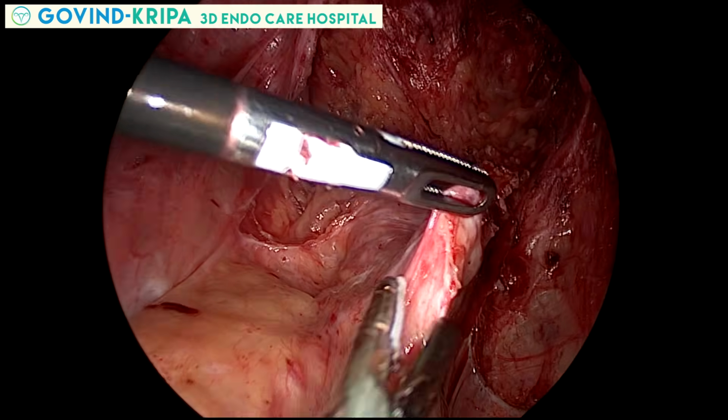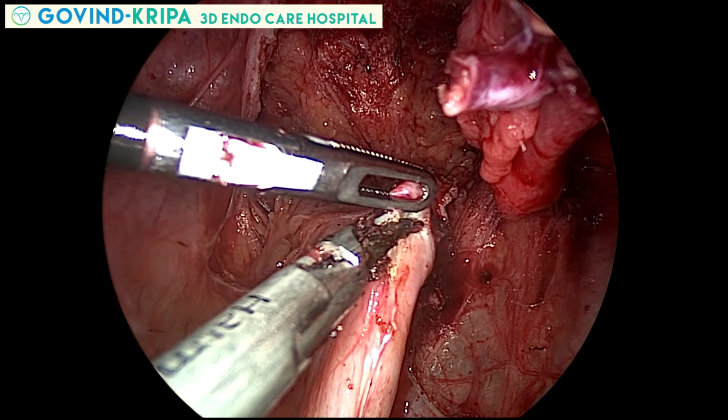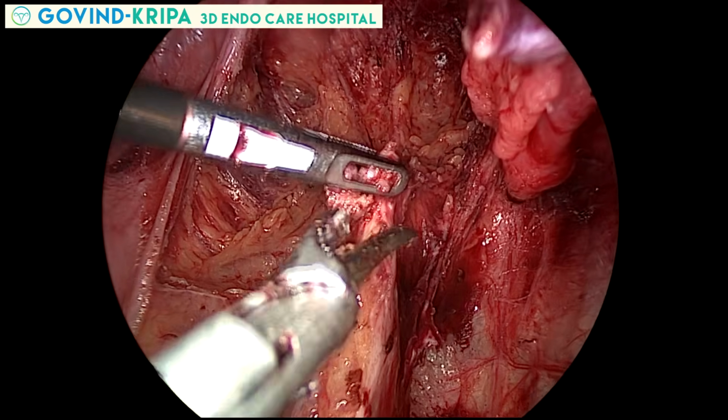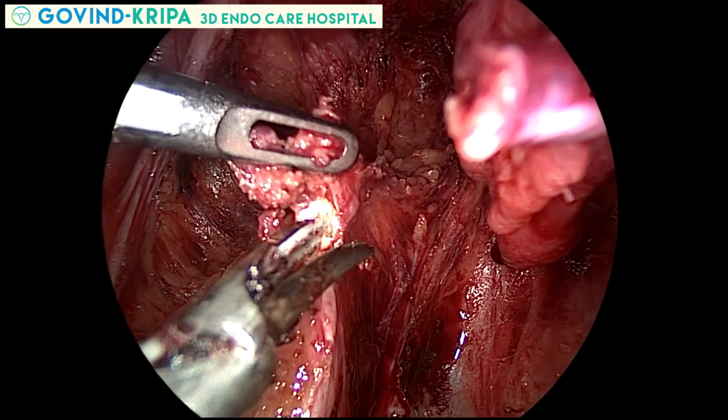Now, nodules over the rectal fat are taken care of. The rectal shaving is mainly dependent on your palpation findings. You have to go deep enough till you feel the normal supple areas of the rectal wall.